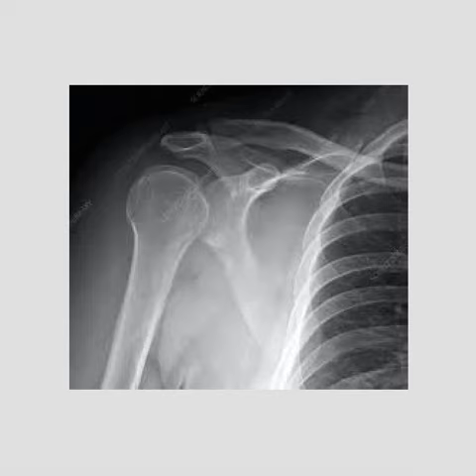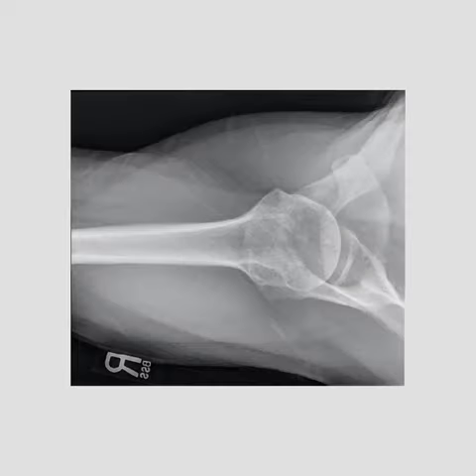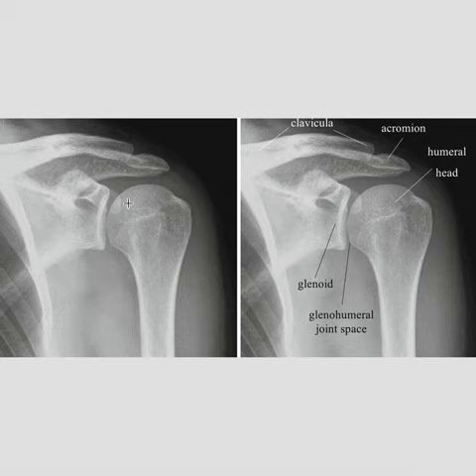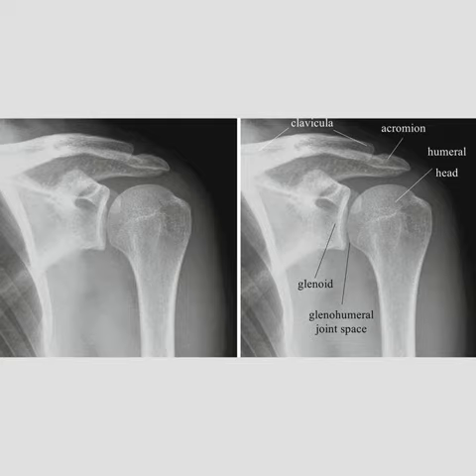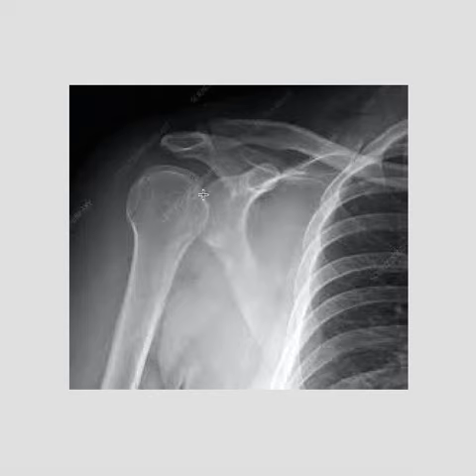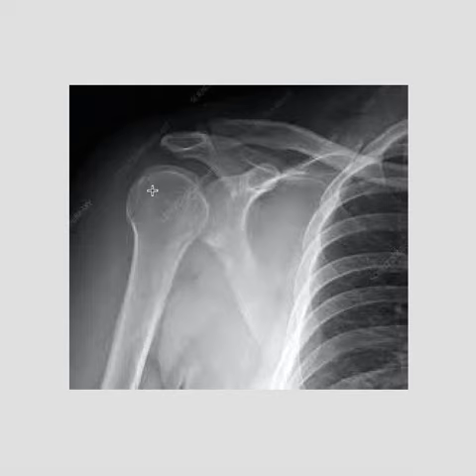Now I want to show you an issue with AP views, because you can be really fooled. This is a posterior dislocation, and it has a couple of classic signs. The most important thing to recognize is that the proximal humerus looks symmetrical. When I talked about the shape of the proximal humerus earlier — the humerus is not supposed to be symmetrical. You're supposed to see the greater tuberosity out laterally. But if you look at this picture, it doesn't really look very asymmetrical. These are very frequently missed, especially on an AP view where you don't have a Grashey view and don't see the incongruence in the joint. This may look quite normal and is often read as normal.